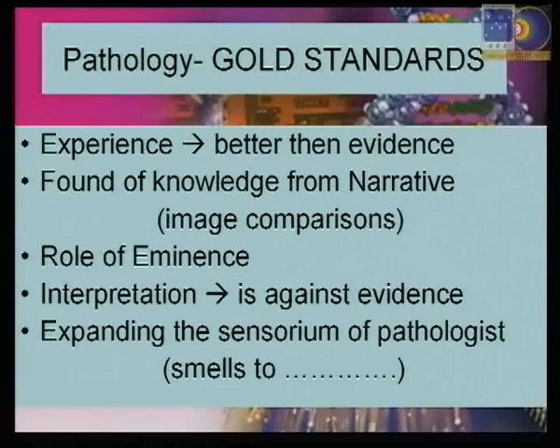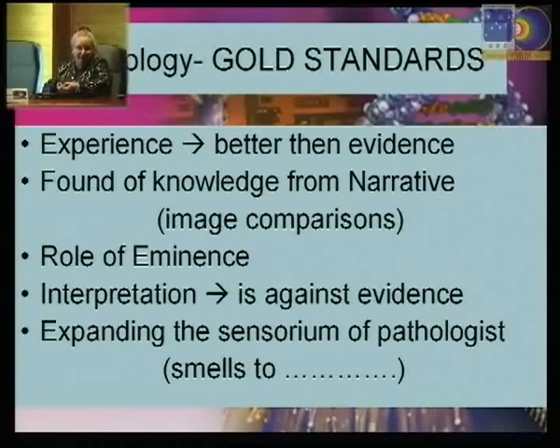Therefore, how can we provide the knowledge to the pathologist? And I say the pathologist because the endoscopists do behave in a different manner. I mean, they are not based on images. They are based on evidence-based medicine. So how can you bring the knowledge to pathology? The only way to bring the knowledge to pathology is to bring sufficient image comparisons and even to let the system automatically find the comparisons in order to bring them to make the diagnosis.